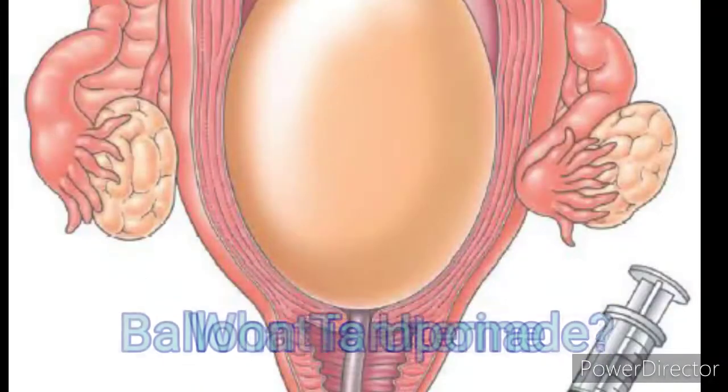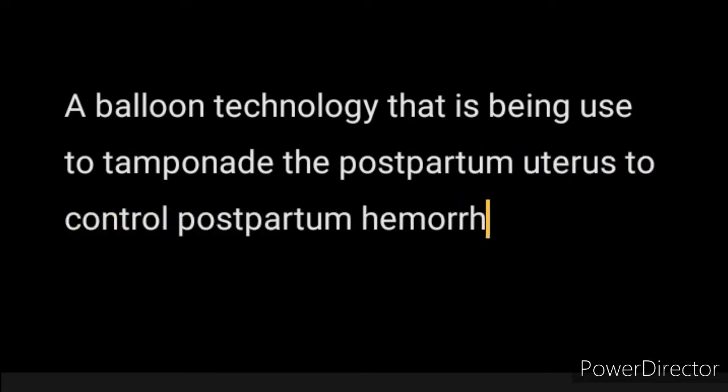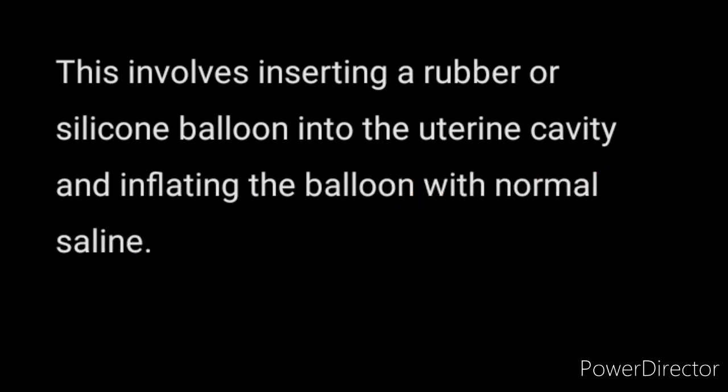This time I will show you how to perform a balloon tamponade. A balloon technology that is being used to tamponade the postpartum uterus to control postpartum hemorrhage. This involves inserting a rubber or silicone balloon into the uterine cavity, inflating the balloon with normal saline.